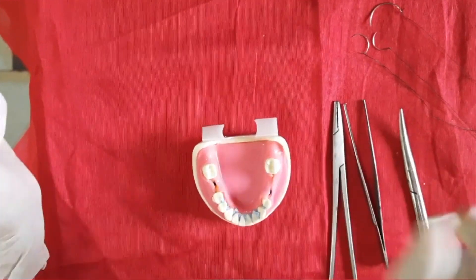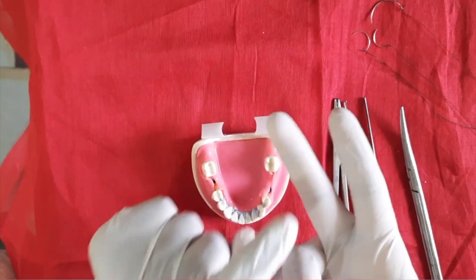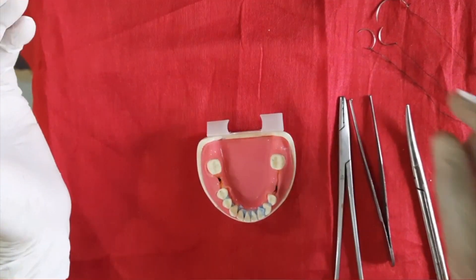Today I am going to show you three types of suture: simple interrupted suture, horizontal mattress suture, and figure of eight suture. First, let me explain the surgical instruments I am going to use.